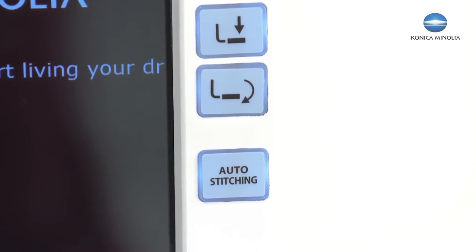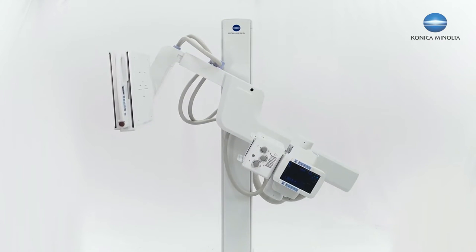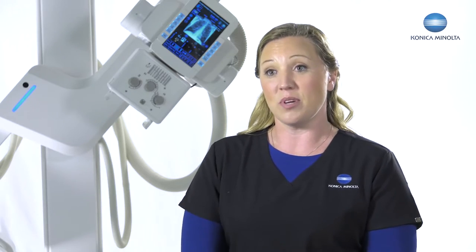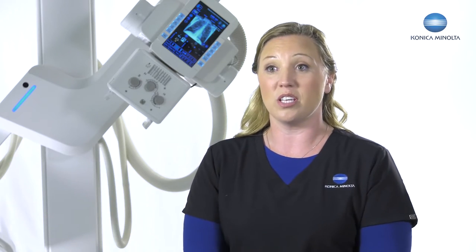I can have both tube side control, detector side control, and also with a remote control. I can do repeat-reject analysis from the tube side. I can adjust from pediatric to adult. I know who my next patient is, I know my patient's date of birth, and I have exactly what view I'm doing on that patient. So it's nice to be able to stand by my patient and have control of the U-Arm while helping my patient feel comfortable standing there getting the x-ray.